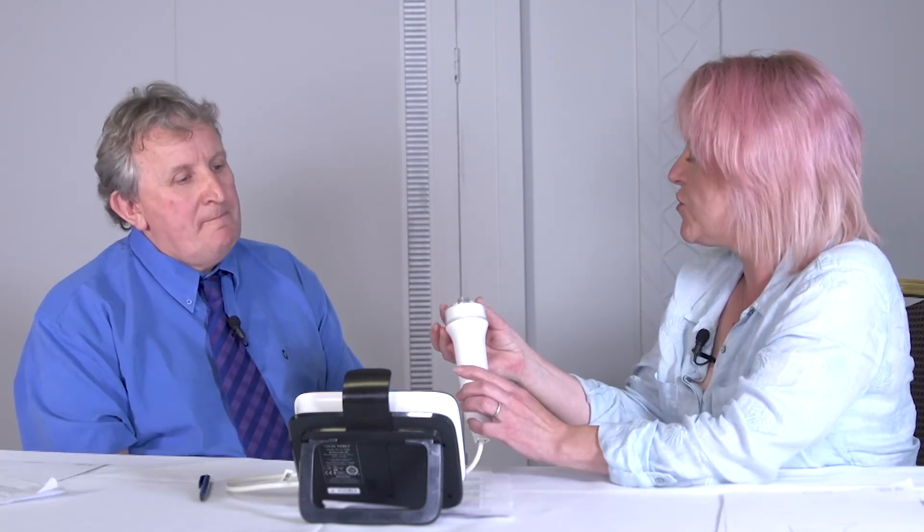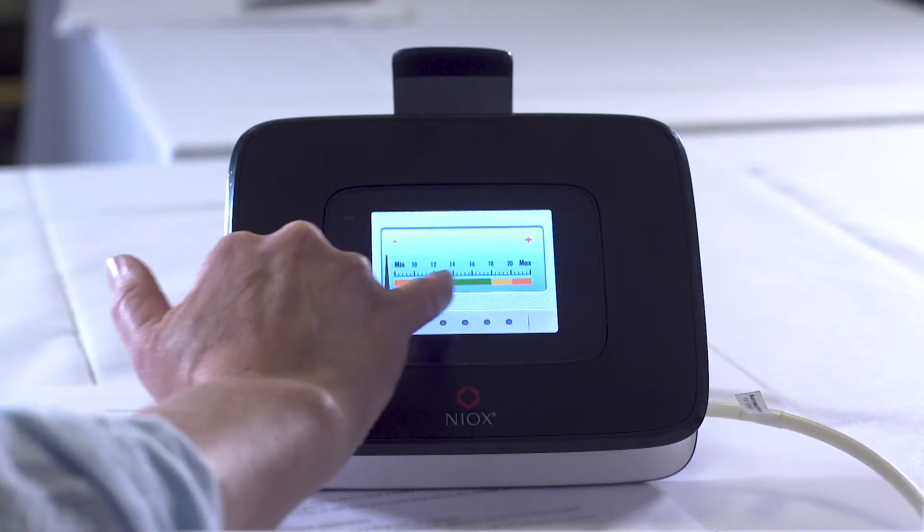What I'm going to be asking you to do: this is the mouthpiece. You'll be breathing out until you've emptied your lungs, then put your mouth around the top and breathe in. As you're breathing in you'll see orange circles filling up. When they are full, you breathe out. You will feel a resistance so you've got to work with it, and this arrow here is going to move into the green area — that's where we want you to keep it, maintaining that same resistance throughout. The test will take 10 seconds of breathing out.